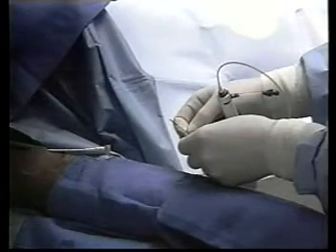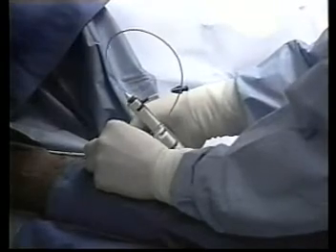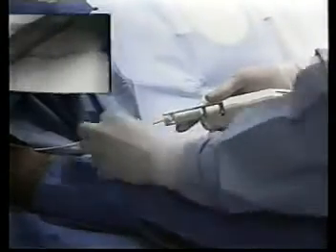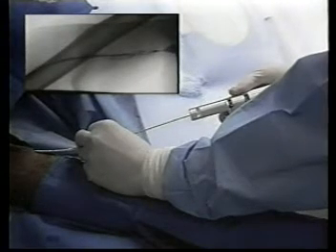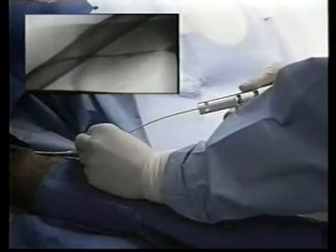With the PTD in the compressed position, insert the catheter through the venous sheath into the venous limb of the graft. Advance the flexible tip of the fragmentation basket up to the venous anastomosis. Do not advance beyond the anastomosis. Expose the fragmentation basket from the outer sheath by sliding the sidearm from the compressed to the deployed position and activate the rotator. Slowly withdraw the rotating fragmentation basket along the graft to break up the clot.